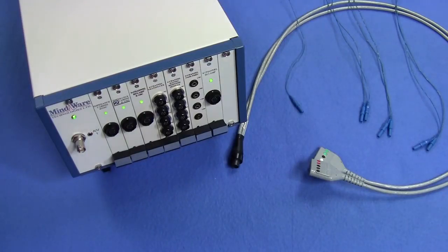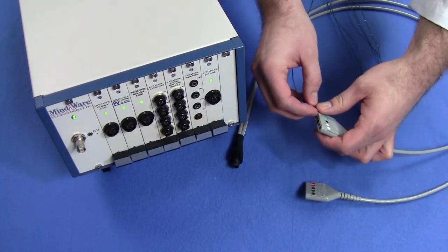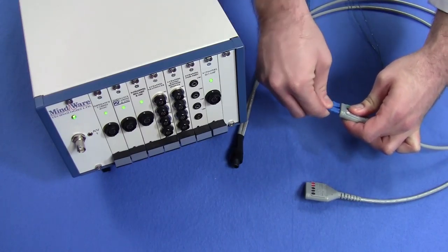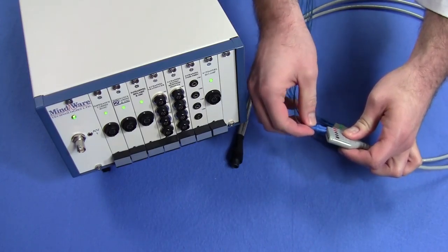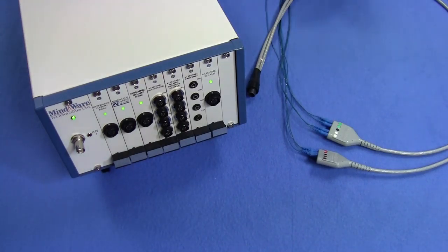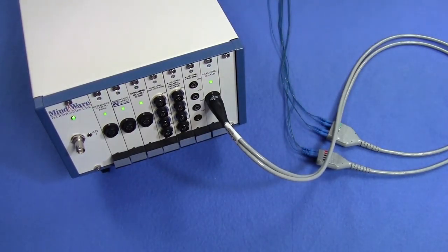Now we need to plug the electrodes into the data acquisition hardware, such as the BioNex or MyoWare Mobile — in this case a BioNex. First, plug the electrodes into the subject harness; there are color-coded pairs in the harness. Ensure that each pair of electrodes associated with each site goes into the same color input on the subject harness. Be sure to grab the electrode by the touchproof connector so as not to damage the wire. Black corresponds to ground. Next, take the other end of the subject harness and plug it into the module being used for data recording, typically a three or four channel module. Now you're ready to begin data collection.